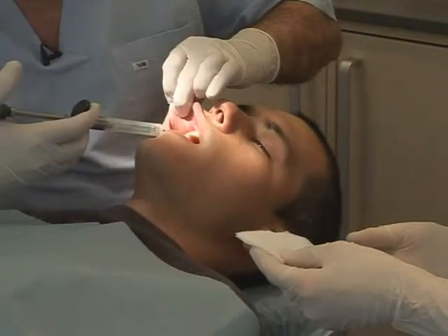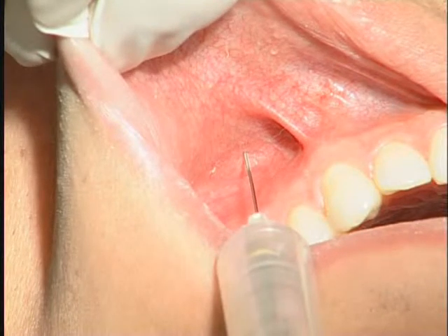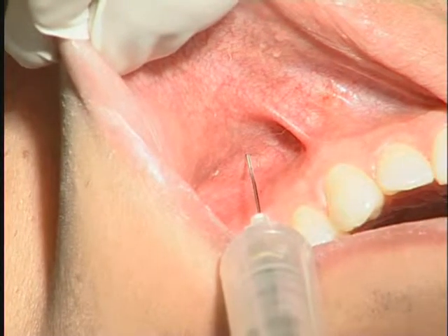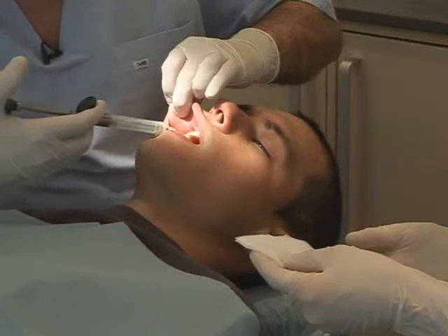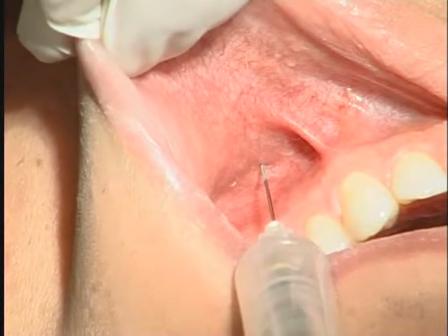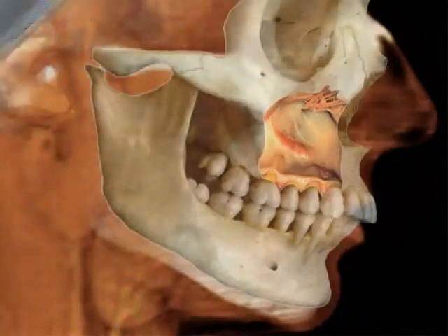With the dental arches in occlusion, the corner of the lip is pulled upwards to free the mucobuccal fold and get a good view of the maxillary wall so that you can evaluate its angle and characteristics. The injection target point is at the bottom of the mucobuccal fold facing the apex of the first premolar behind the canine pillar. The needle goes in vertically and parallel to the bone wall at an average depth of 15 to 20 millimeters for a maxilla averaging 4 to 5 centimeters in height.